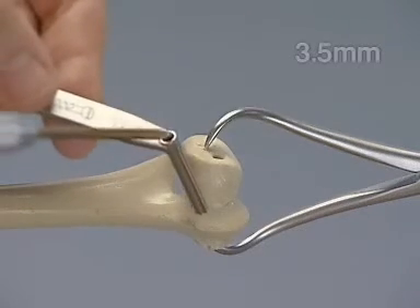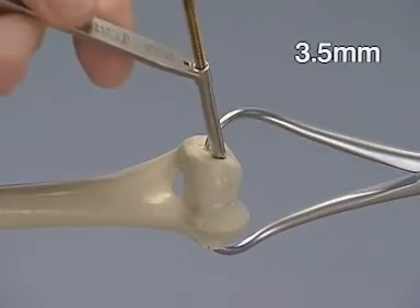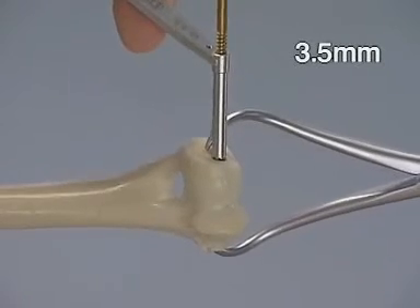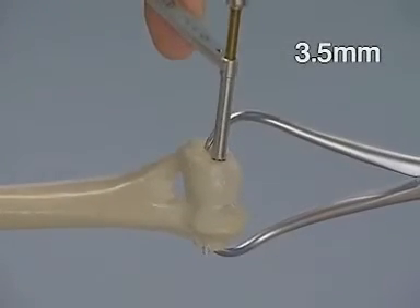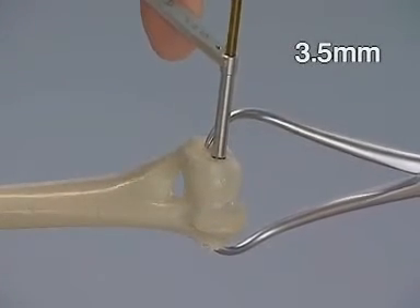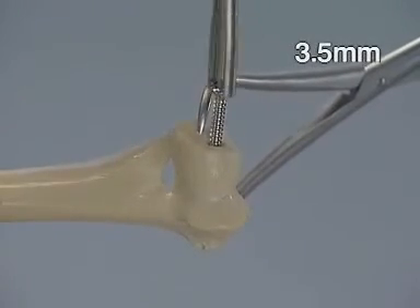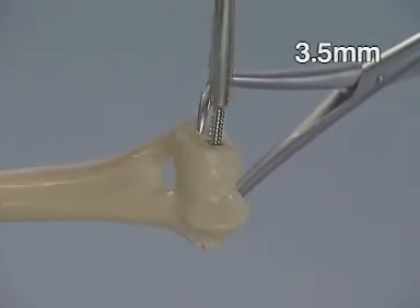The 3.5 mm tap through the double drill sleeve is used to cut the thread in the thread hole. The appropriate 3.5 mm cortex screw is inserted, achieving compression along the fracture line.